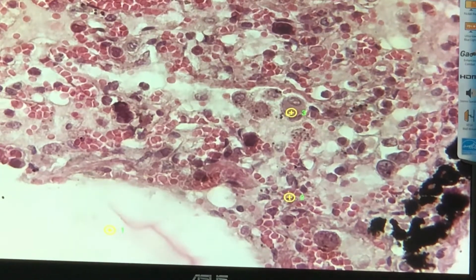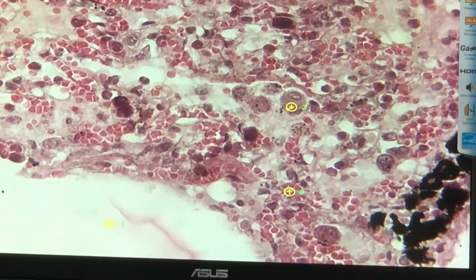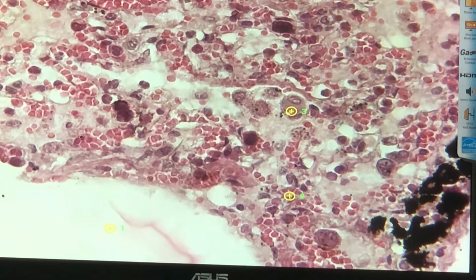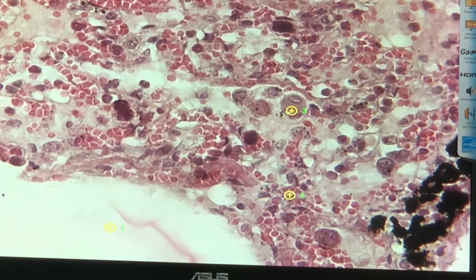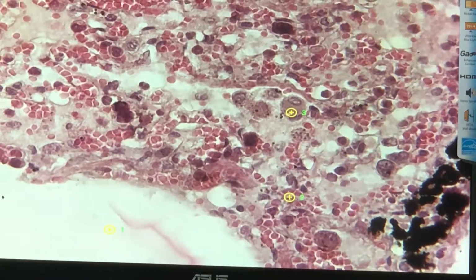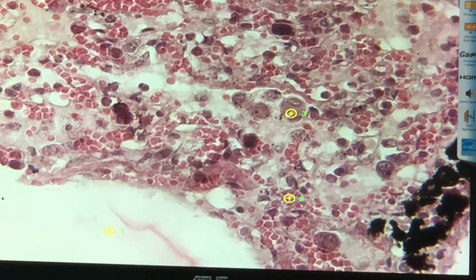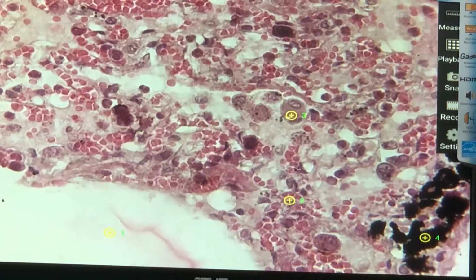Hemosiderin is foreign in the lung tissue, so the macrophages will try to eradicate it. That's why you have golden brown pigment inside the macrophages. By what process? Macrophages eating the hemosiderin, what is the pathologic term? Phagocytosis.